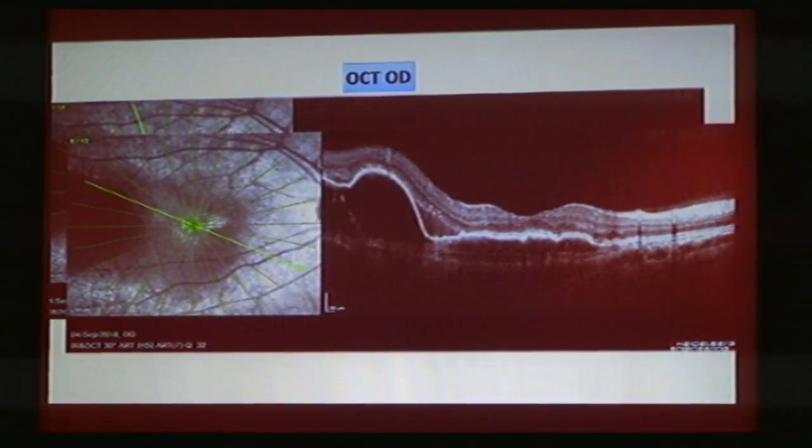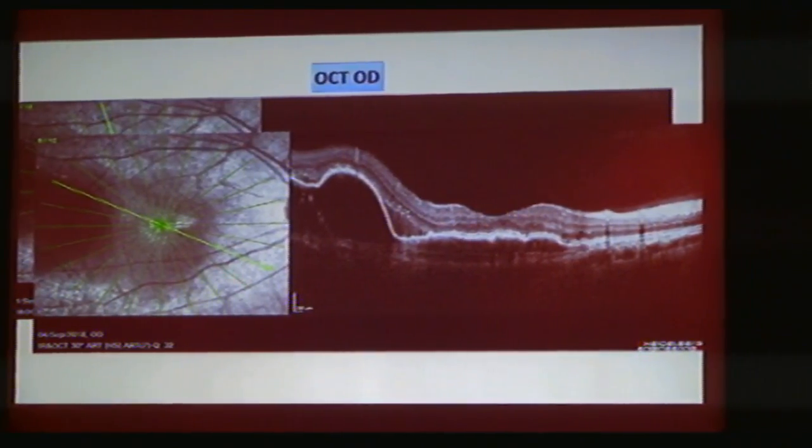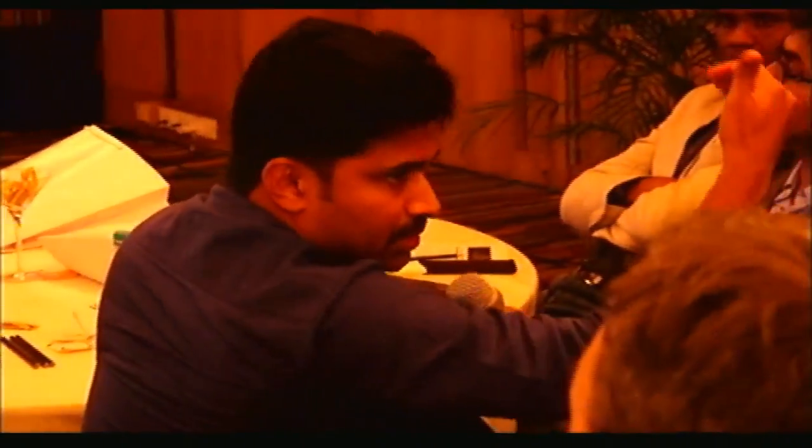This patient has no drusen whatsoever. What else can it be? No drusen, increased thickness of the choroid. Yeah, so definitely this is PCV. Maybe the BVN is not shown in that large PED area, maybe because of the hemorrhage. Once the height decreases, the BVN might become prominent. The only concern is what to do now, like as you suggest.